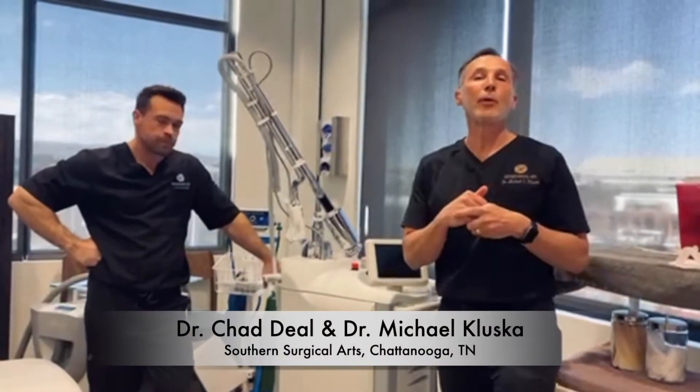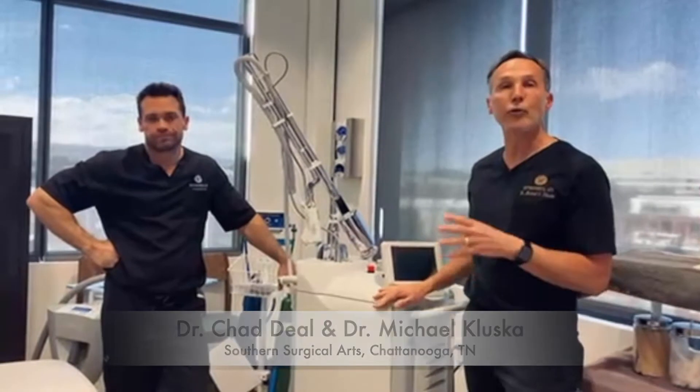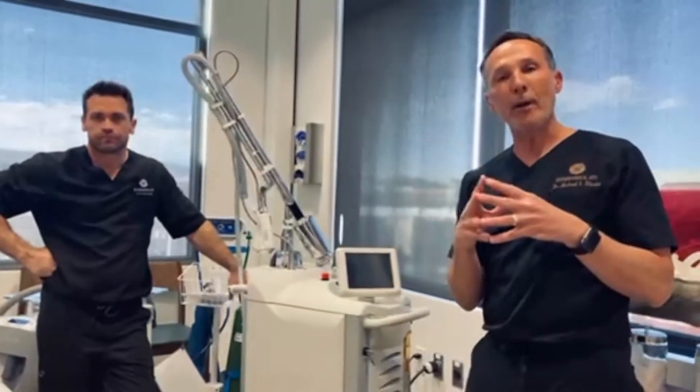Hey everybody, Dr. Kluska here, bringing you this month's Aesthetic Authority. This month we're speaking about Sciton's Jewel Laser — an American-made, hardy laser that has multi-functions. Today we're going to discuss all the little details about this laser.